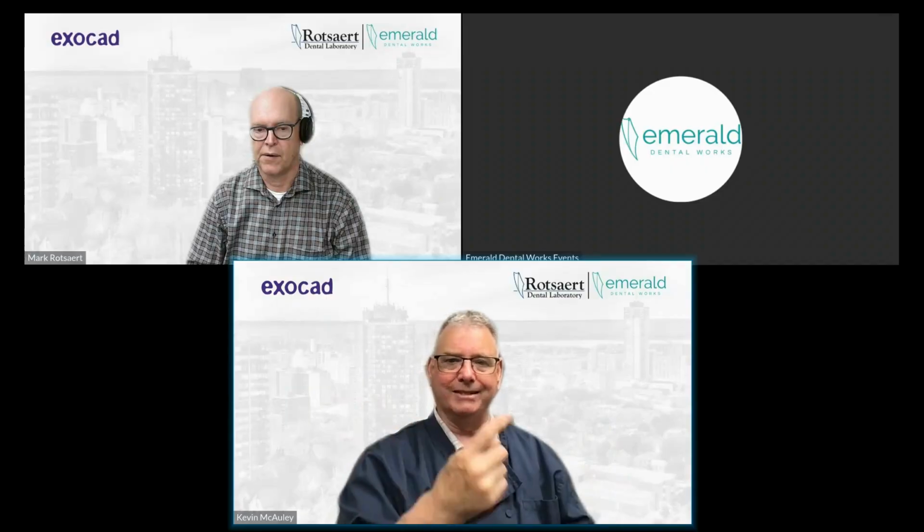Then we do a live review if needed, depending on the case. The more you do, the less one-on-one has to happen, I find, because we get to know what you're working with and get used to each other. The web meeting is just like this, where we log on, pull up the software, and do it live. We can come to the office if it came to that, but a web meeting is usually enough to show a 360 view around every implant, understand that aspect of it, and make sure we're safe.